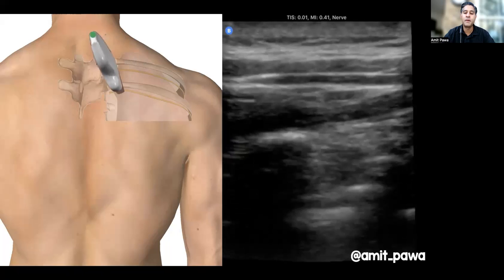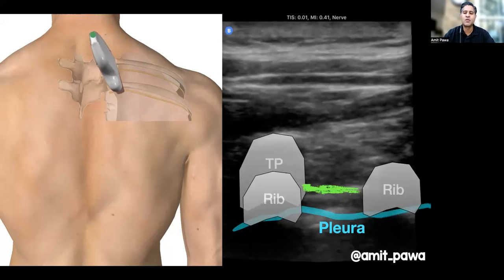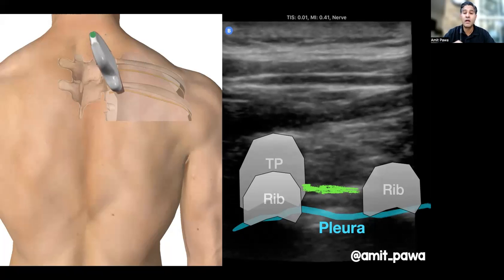I've slightly obliqued the caudal part of the probe, and you can appreciate the shadow of the transverse process with an underlying rib. On the right-hand side, the lower shadow of the rib — you can see the superior costo-transverse ligament, the pleura, and the space between them is the paravertebral space.